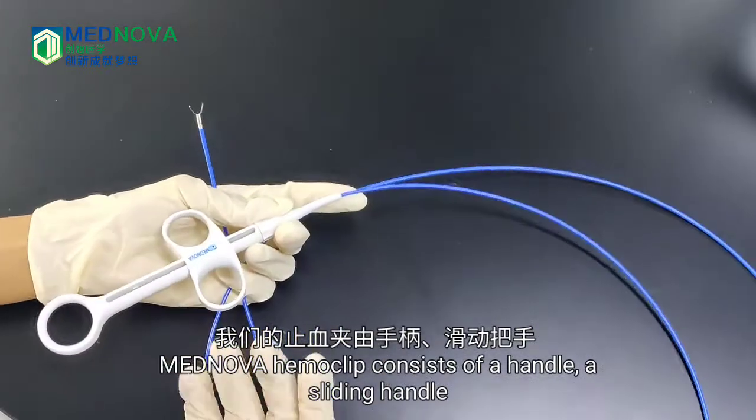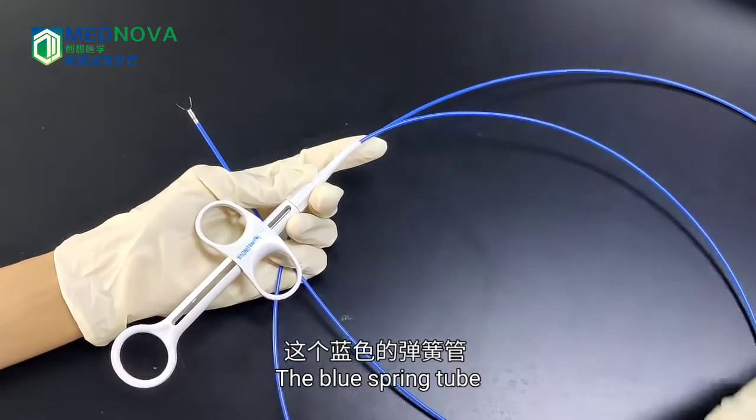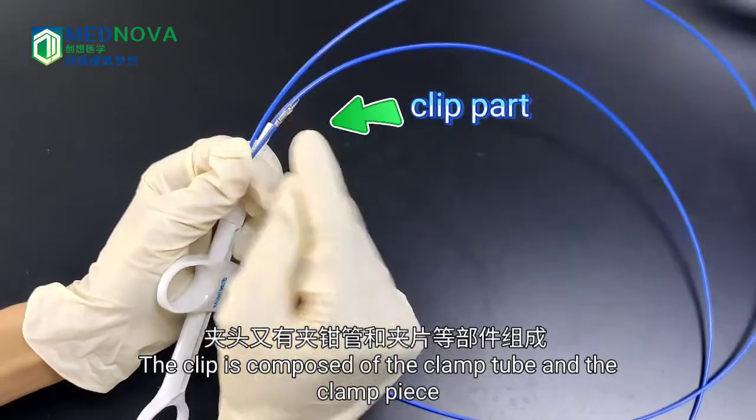Observe whether there is any abnormality in the clip and whether it can be opened and closed normally. MEDNOVA hemoclip consists of a handle, a sliding handle, the blue spring tube, and the clip part. The clip is composed of the clamp tube and the clamp piece.